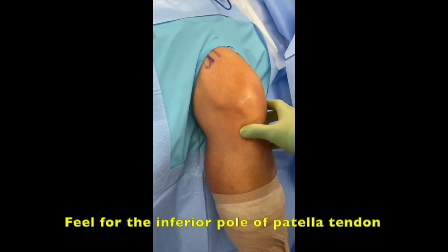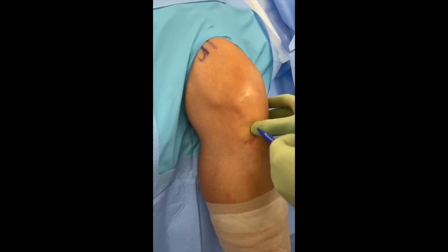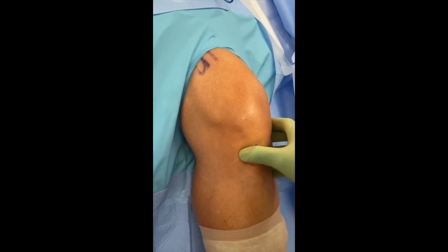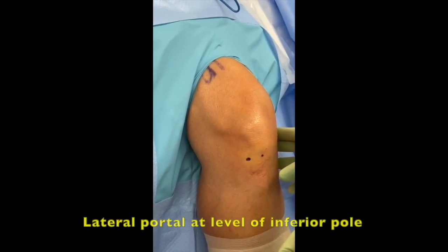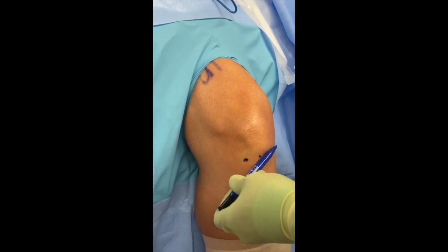Feel the inferior pole of the patella, just off the patellar tendon at the level of the inferior pole. Here's the inferior pole — we'll feel the patellar tendon, roll over it, and right at that level we'll make our high and tight lateral portal, then typically take this marker and roll over.